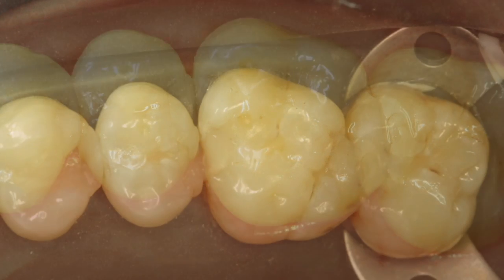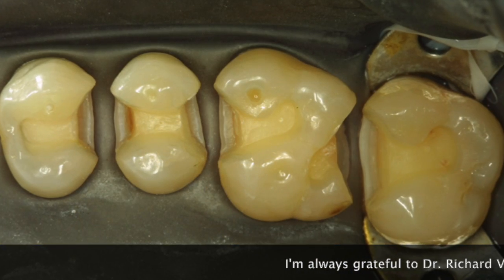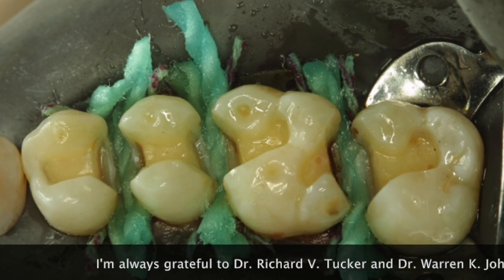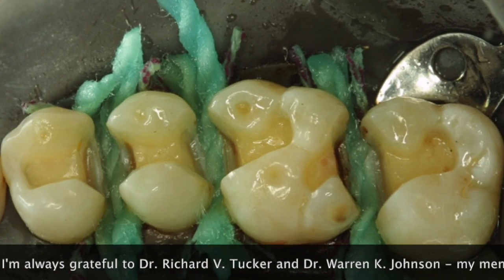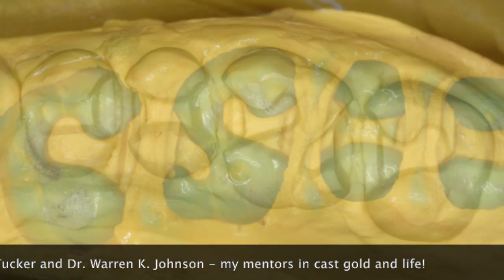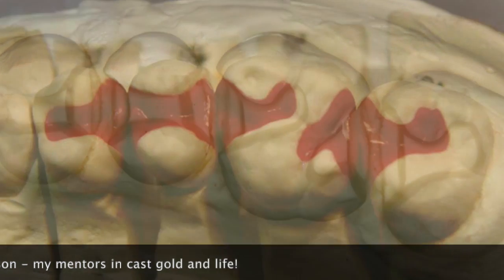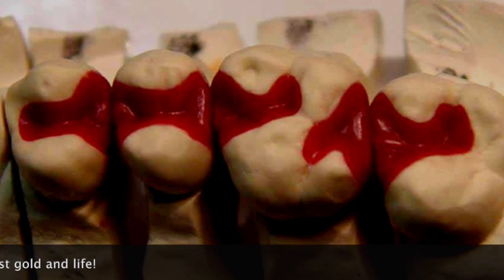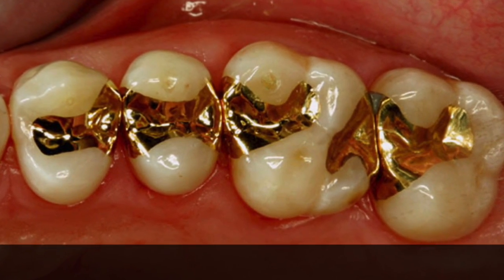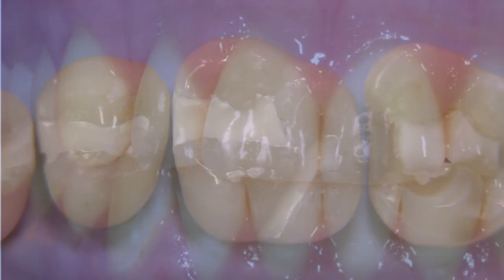I'm showing you one of my cases where we were replacing defective composite restorations with little inlays. You can see the extensions seem a little bit more than you might be used to seeing, but the gold will be nicely hidden. Here are the dies and the wax-ups, just using a red wax today, and the final restorations as they're delivered. When you see all of these castings while the patient smiles, you don't see a single restoration showing.